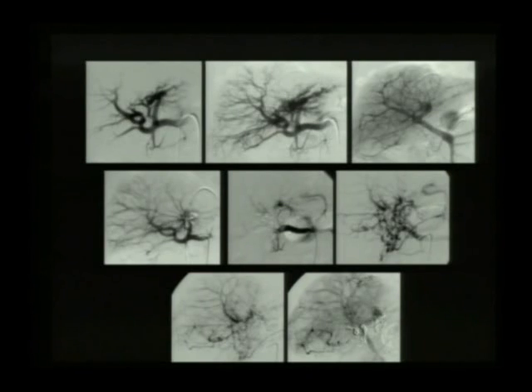He had one single coil put in at this other center, but when he came to us, and you look carefully at the arterial injection, you can see all these tram lines from the periphery. These were occurring predominantly in the right side of the liver, but also in this dysplastic area here in the left liver, and this is refilling of the peripheral portal veins from multiple arteriovenous fistulae in the liver. And this is the reversal of flow in the portal vein following his hepatic artery injection.